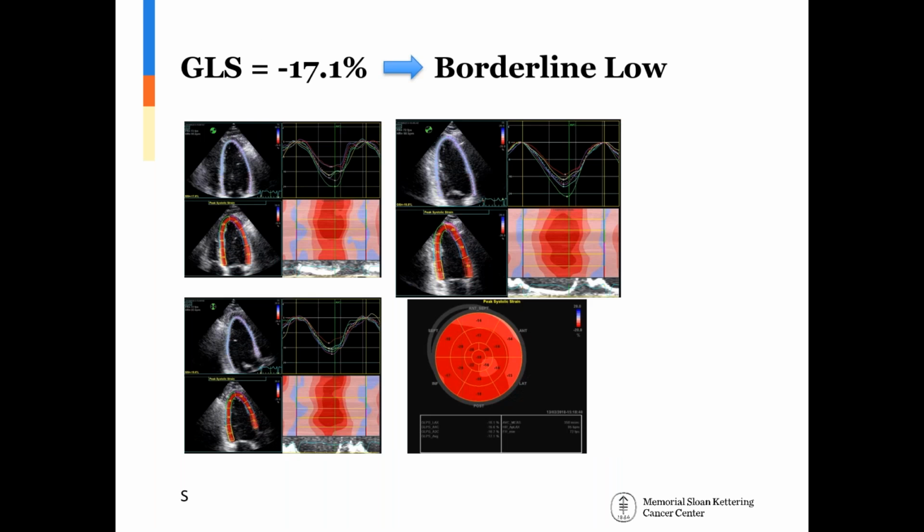And so at Sloan Kettering, do you have a higher percentage of baseline echoes that have that quality of strain?